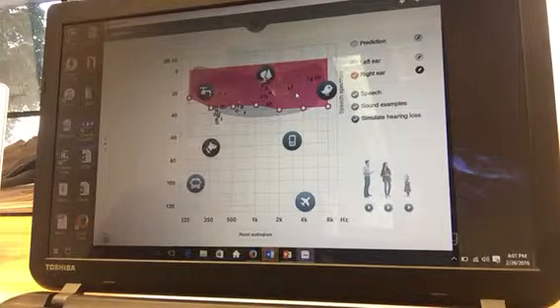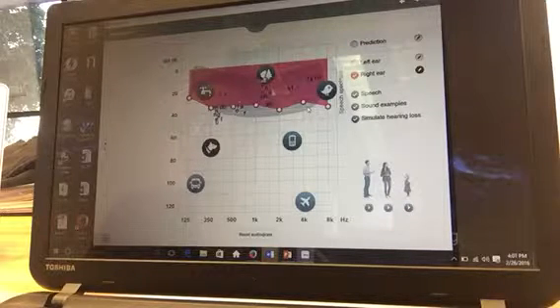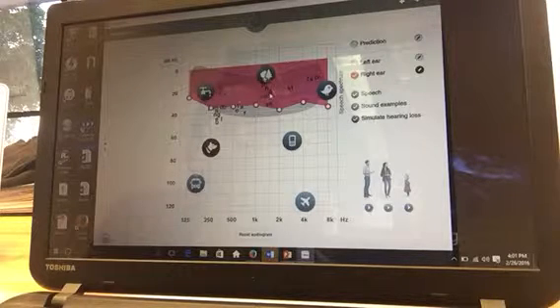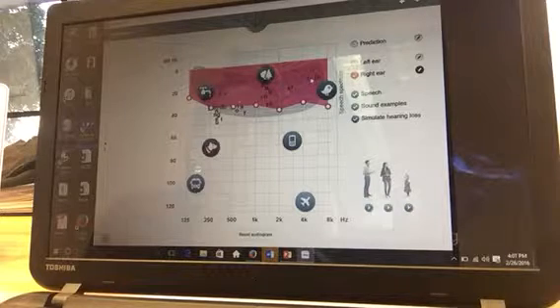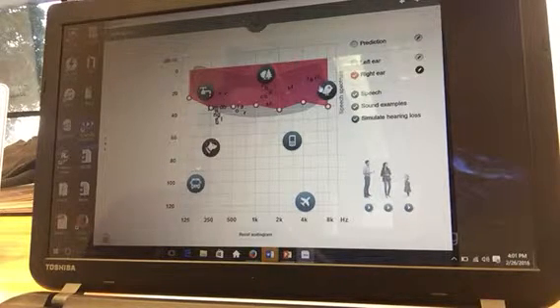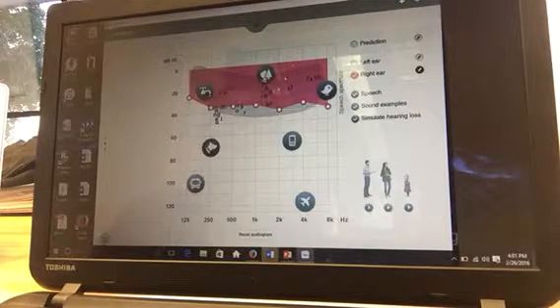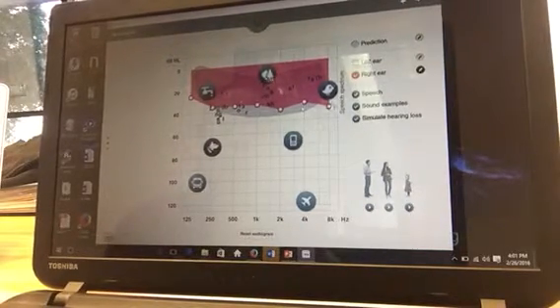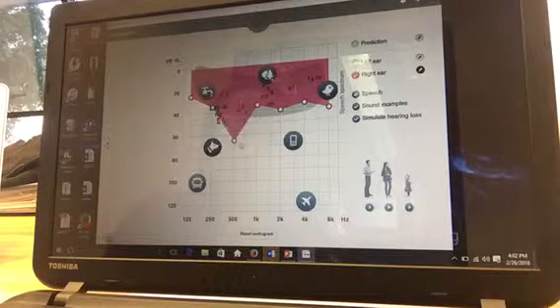So as you can see, he cannot hear a lot of familiar sounds, and this type of loss would mean that he is missing out on many of the mid-pitch sounds like the P, the H, the G, as well as the crucial higher pitched F, S, and TH sounds. Now, we can try to take a listen to some of the sounds that he's currently hearing, so you can just kind of get an idea.